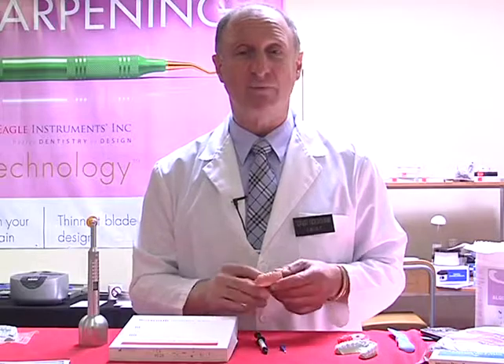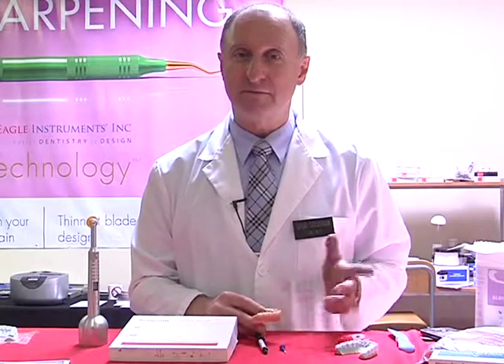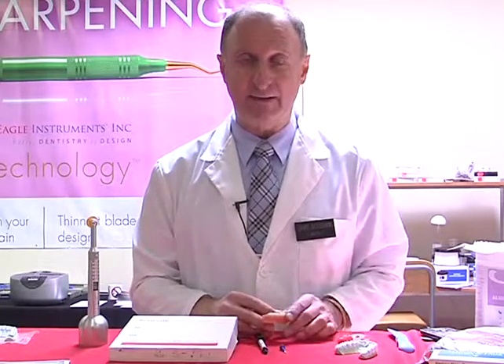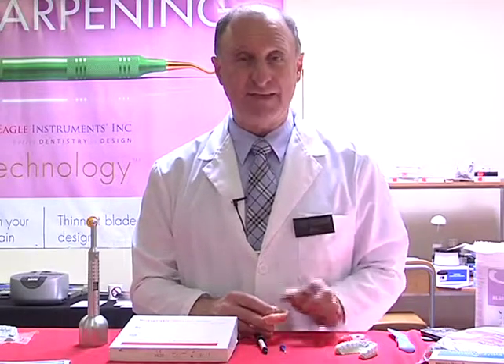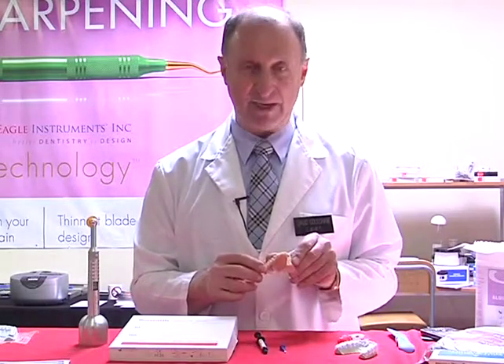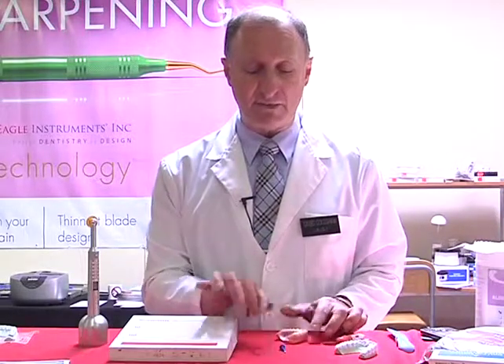So instead of that, we're going to have a much simpler method. We will go to and pick up an indelible pen. Now that can be like a Sharpie style of pen you can pick up at any of the major stores out there. And make sure it's a fine tip. Write the patient information, allergic reaction, name, in a convenient area out of the way. Let it dry.